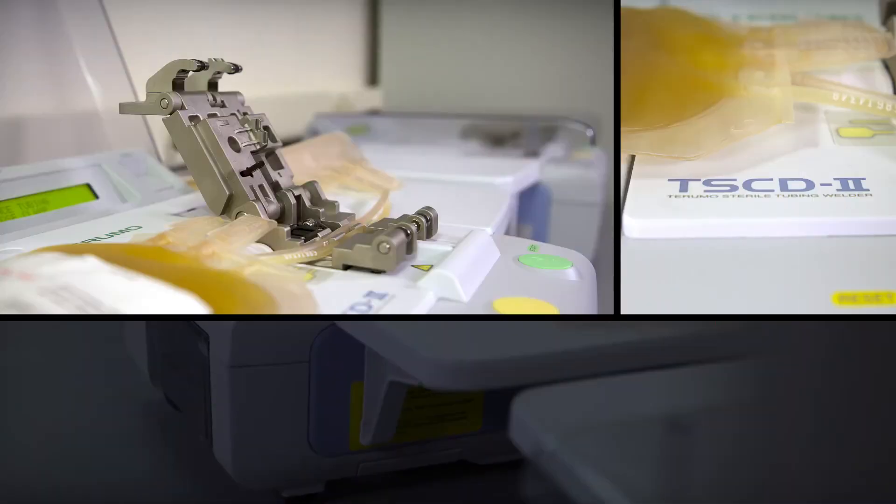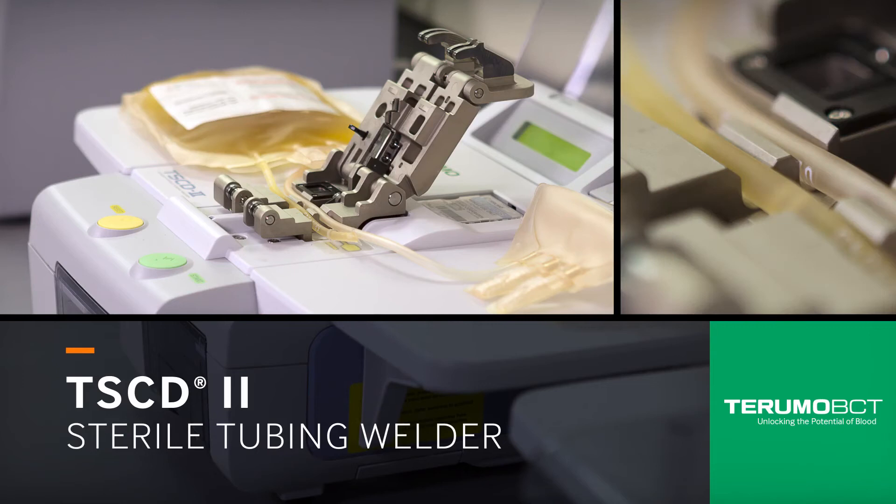Professionals who need reliable seals look to the TS-CD2 sterile tubing welder.